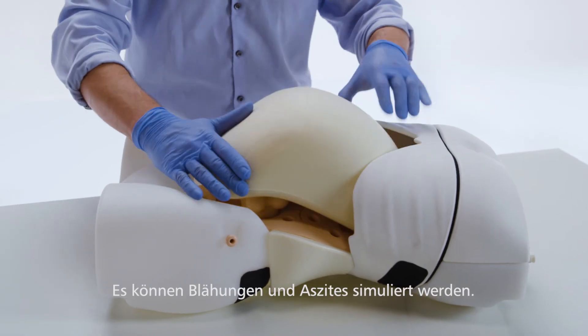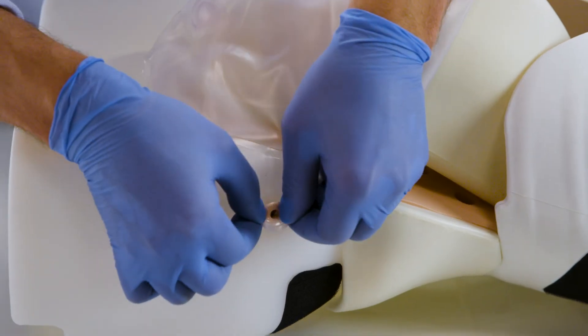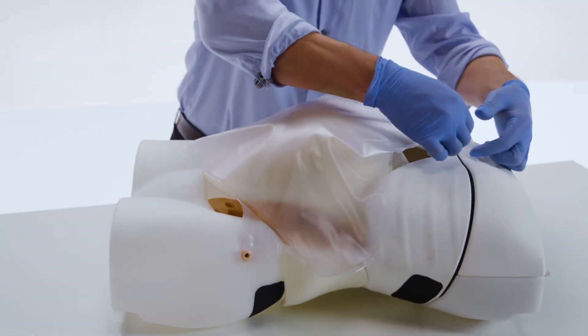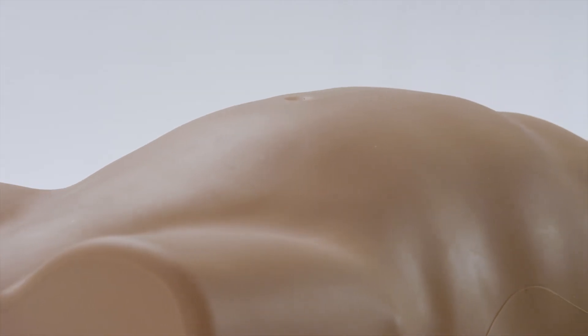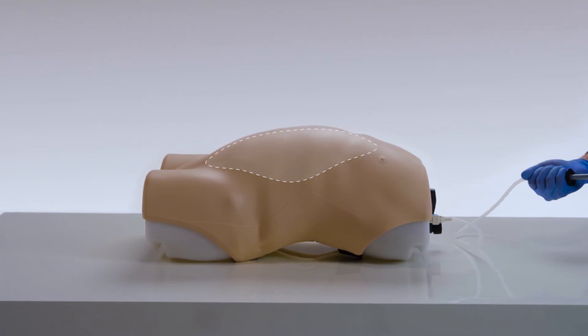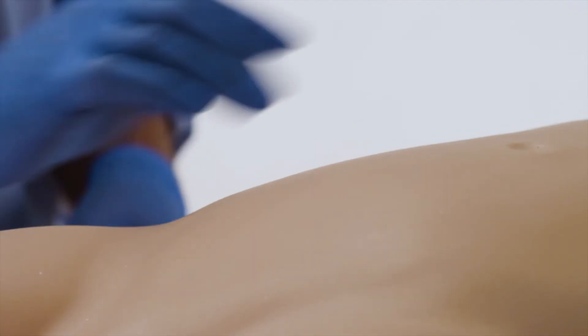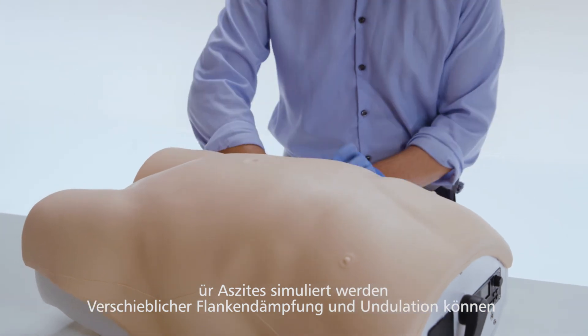Both gaseous distension and ascites can be simulated. For ascites, shifting dullness and fluid thrill can be performed.